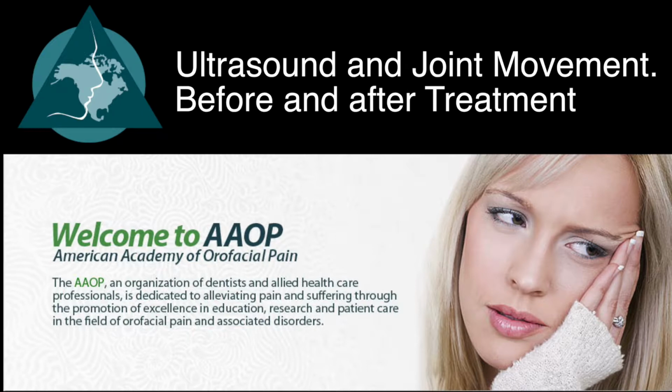So do you use it to correlate what you think is happening clinically and then check it out with the ultrasound? Absolutely, yeah. And I think initially when somebody is getting familiar with ultrasound, you're going to be checking a lot more things than you will down the road, which is good because you really want to get familiar with how things are moving, what the different tissues look like, if you have them move side to side or stick their jaw forward, what are you looking at?